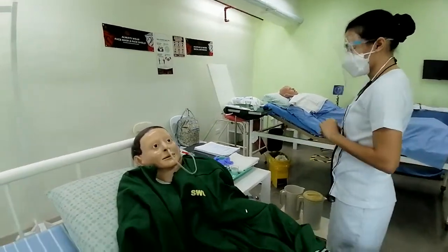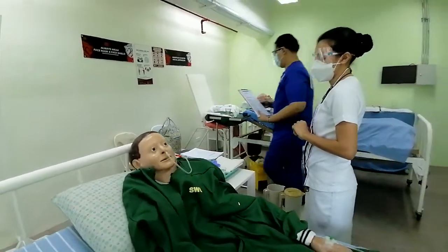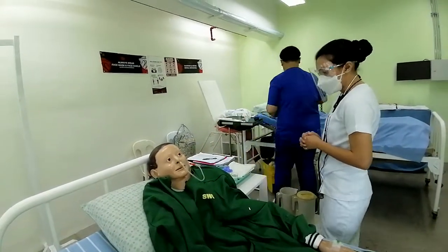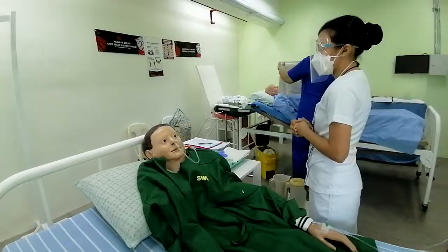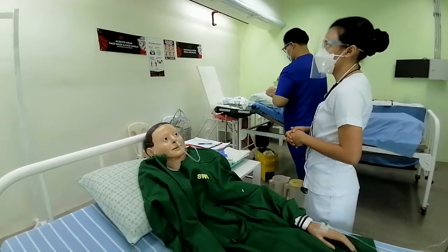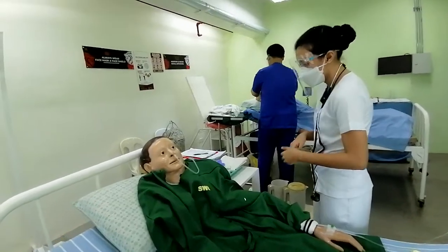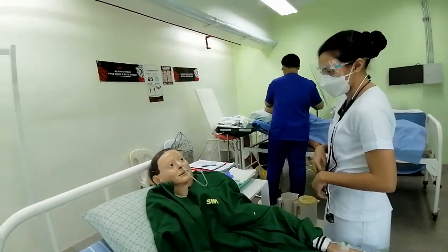So today, I will be performing NGT. So first, I will verify the patient's need for enteral feeding and ask if there are any allergies to food, because we need to prevent the patient from having allergic reactions. So sir, do you have any food allergies?